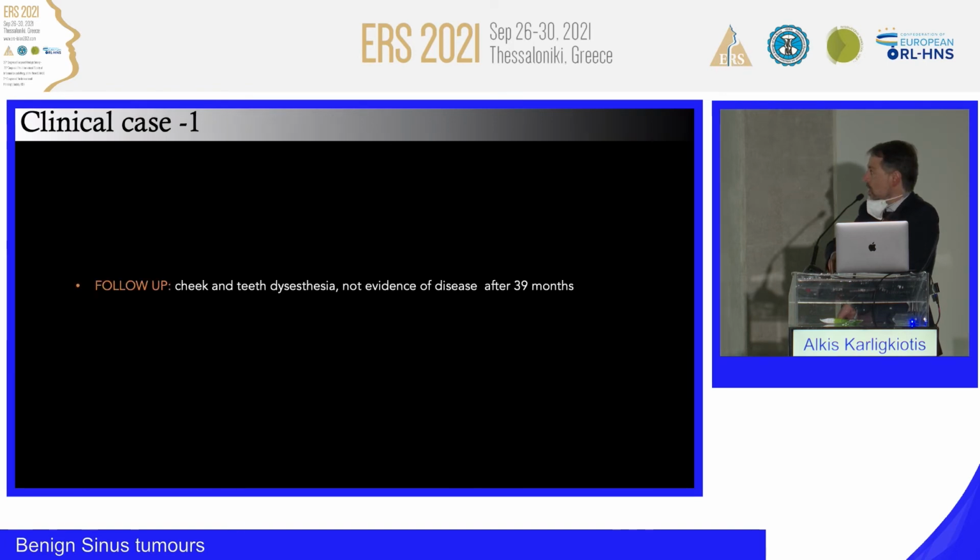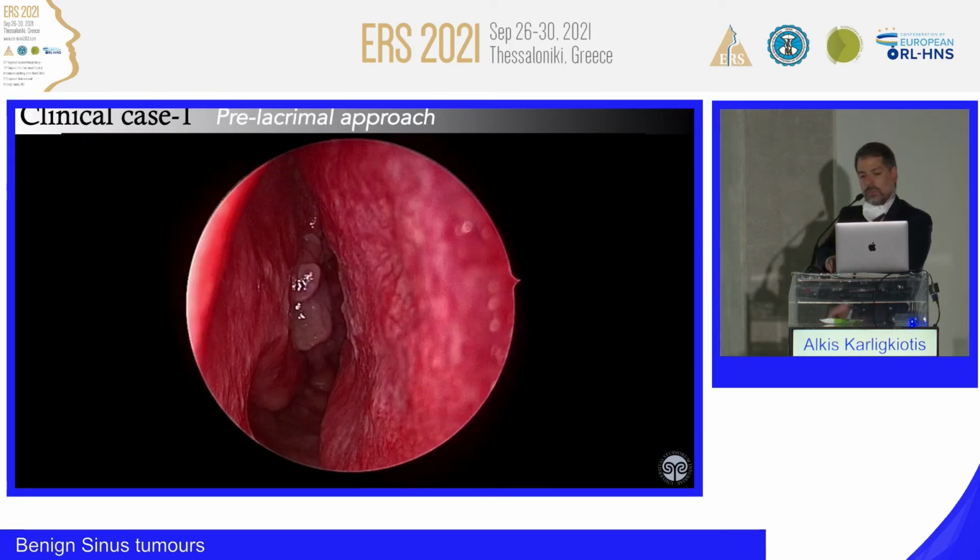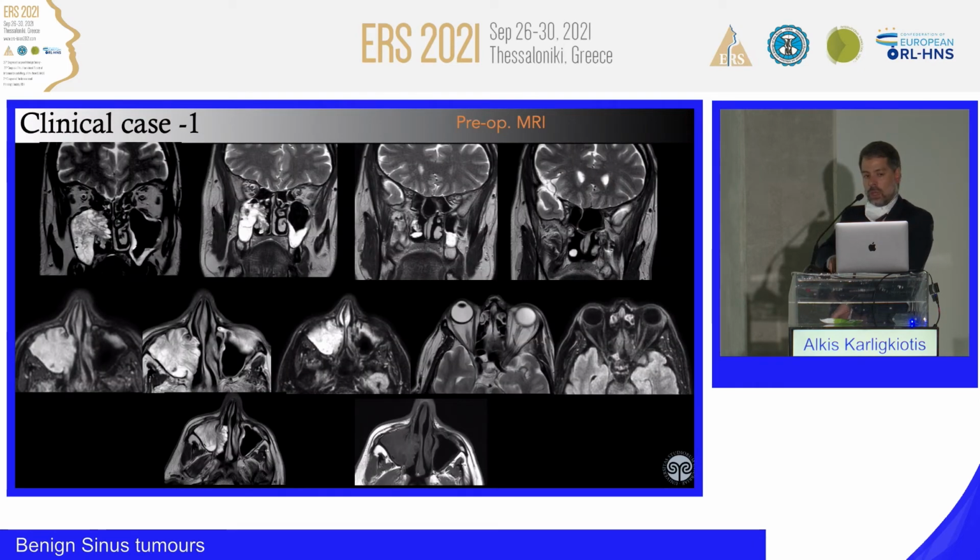Before showing you the video, I would like to ask you, in such a case, what option would you offer to the patient, and then of course I will show you what we did. Do you think you start with Denker's approach, medial maxillectomy, removing all the medial wall? I would go for a modified medial maxillectomy, leaving the nasolacrimal duct system intact, and we have a nice type 3 prelacrimal window in this case. So you would go for a prelacrimal approach? Prelacrimal maybe combined with postlacrimal sinusotomy type 3. Would anybody do something different on the panel?